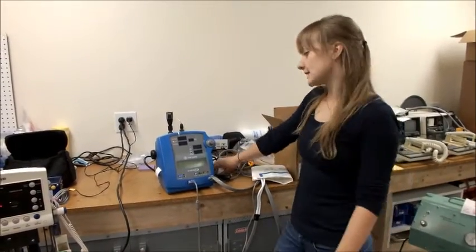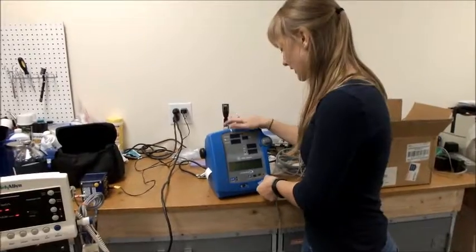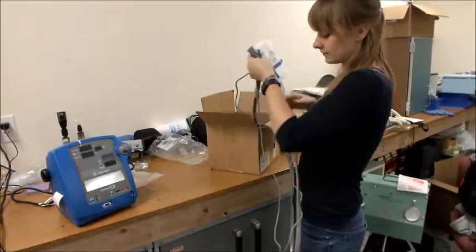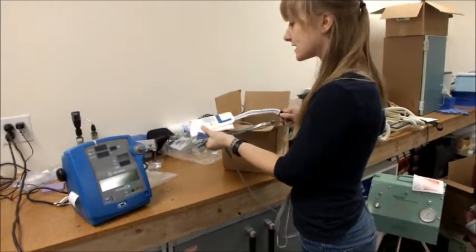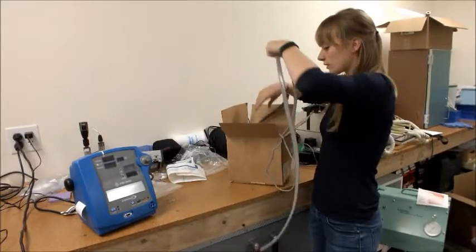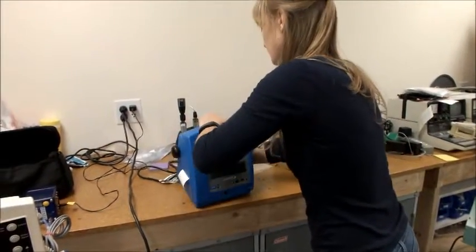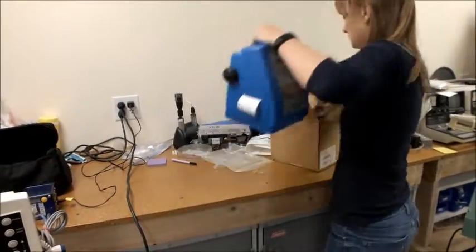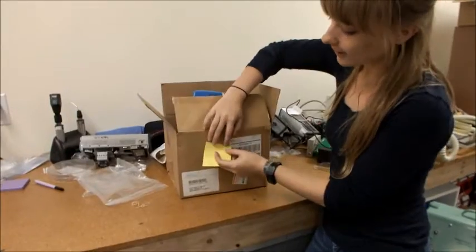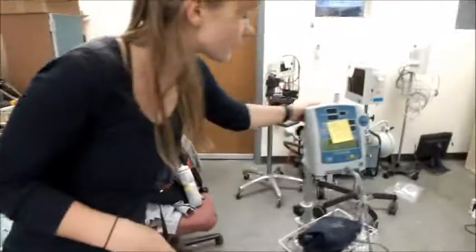Once you've finished testing your device, you can set it up to either be cleaned or to be fixed. Take all of the tubing that you used to test your device and keep it with the machine that you tested. You'll want to detach all blood pressure cuffs or attachments because they're going to continue to be used for testing. Put all of the cords into the box along with the machine and power cord, and then put a sticker that gives the device's diagnosis on the front. In this case, the device was working.